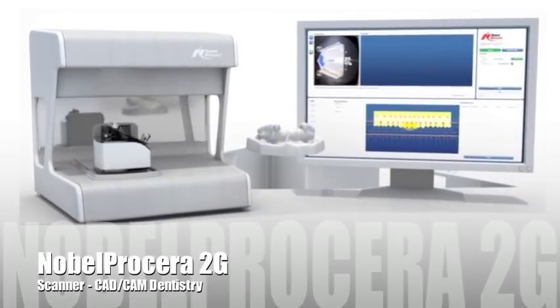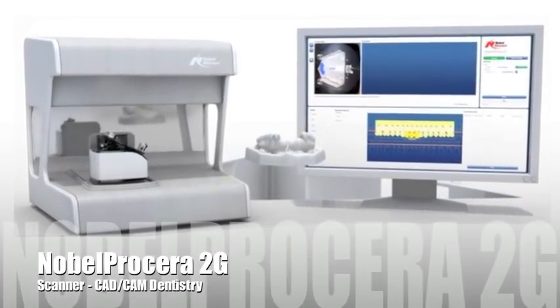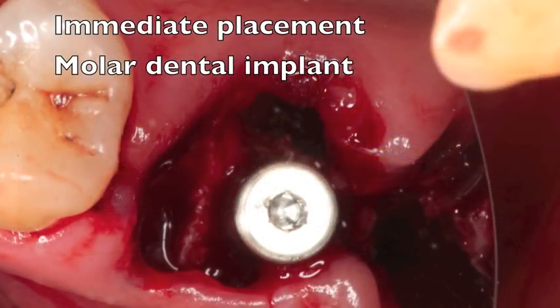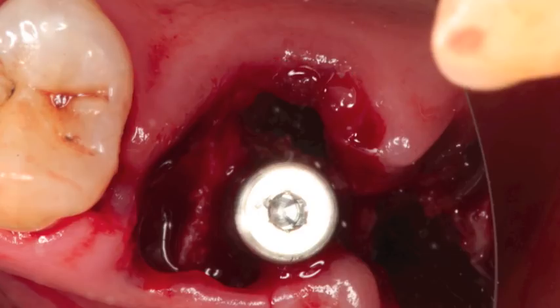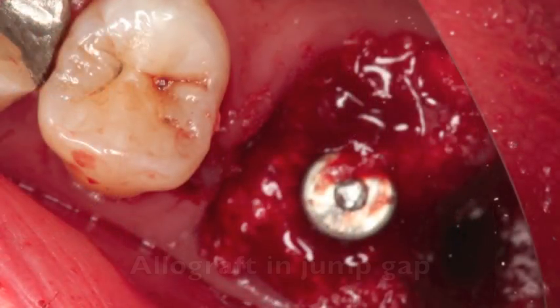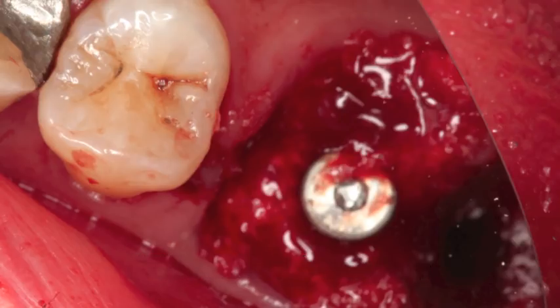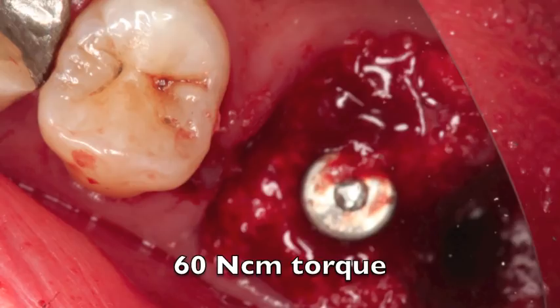The angulated screw channel is a feature of the Nobel Procera 2G scanner. This case begins about five months ago when I placed an immediate implant into a molar socket area. I put it in the furcation area but it slid a little bit distally. You can see that it's not ideal but it's okay, so we decided to leave it there and restore it. We put some bone grafting allograft material in and then let it heal for about four months.